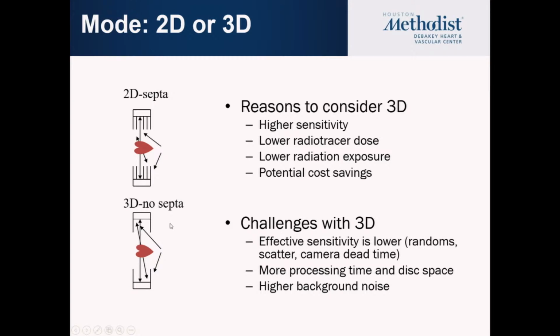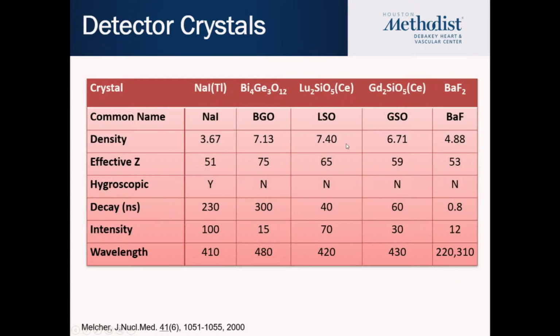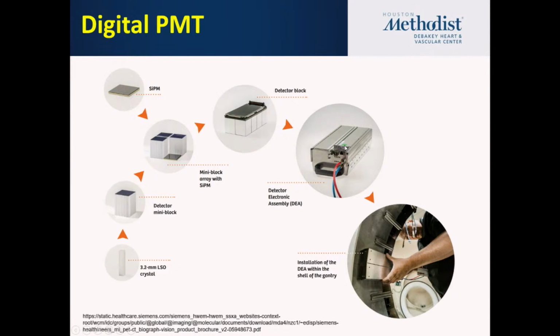Now, the digital PET has to do with what is beyond the detector, so it's not at the detector level, it's at a higher level. So it's mainly the photomultiplier, what happens in there. Beyond the detector, this is the detector, whether you have septae in front of it or not. For the digital one, now you're talking about a photomultiplier, which is more digital.